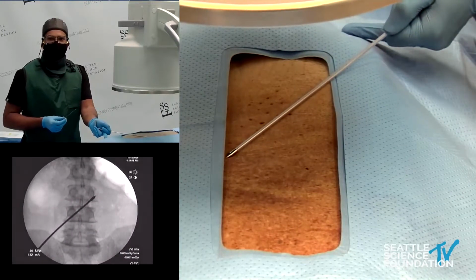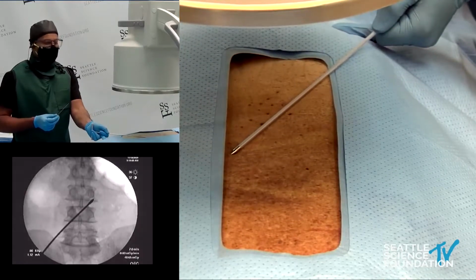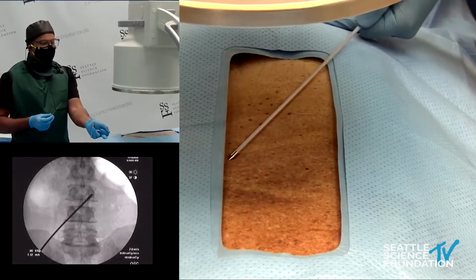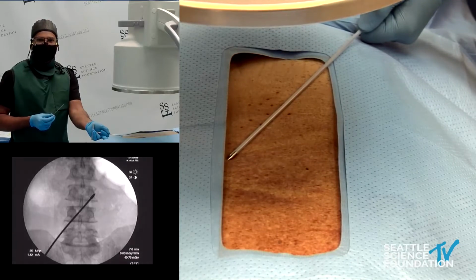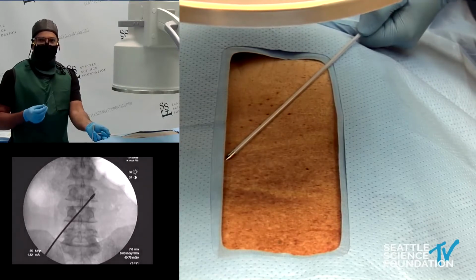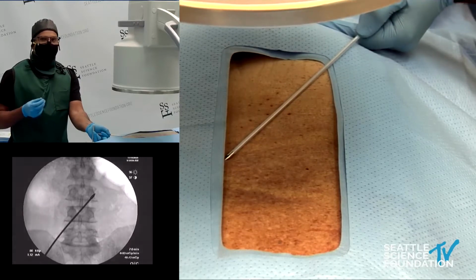And you can see what I'm doing here is I'm rotating my tunneling tool, this straight tool, and I'm creating a line from the L3 pedicle through the epidural space, as you can see that interlaminar window. So this is going to be the line I'm going to take for my needle. It's really important to draw out on your patients exactly what you're going to do. I would say that's true for all of stimulation.